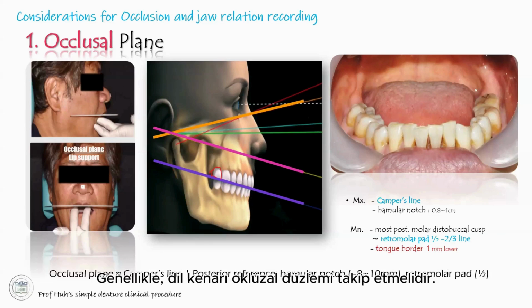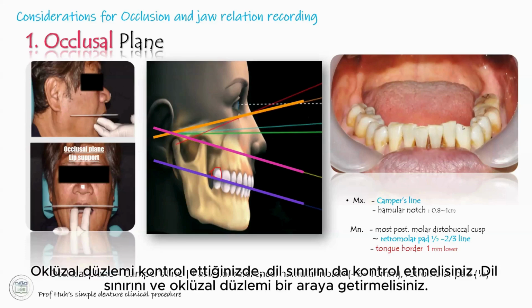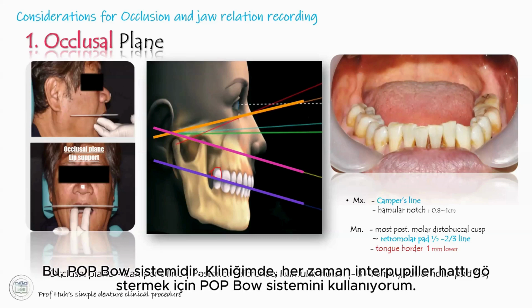Generally, the tongue border has to follow the occlusal plane. So when you check the occlusal plane, you had better check the tongue border. You have to match the tongue border and the occlusal plane together. Okay, let's move on.